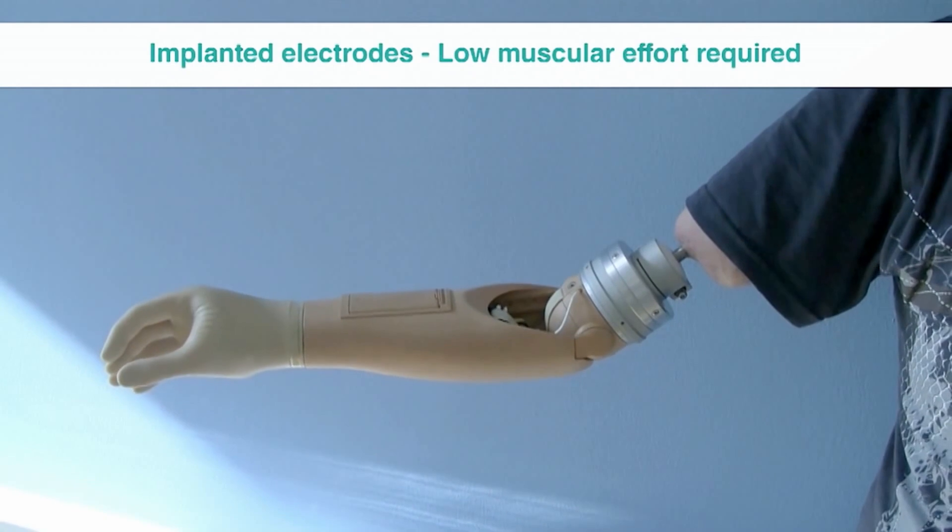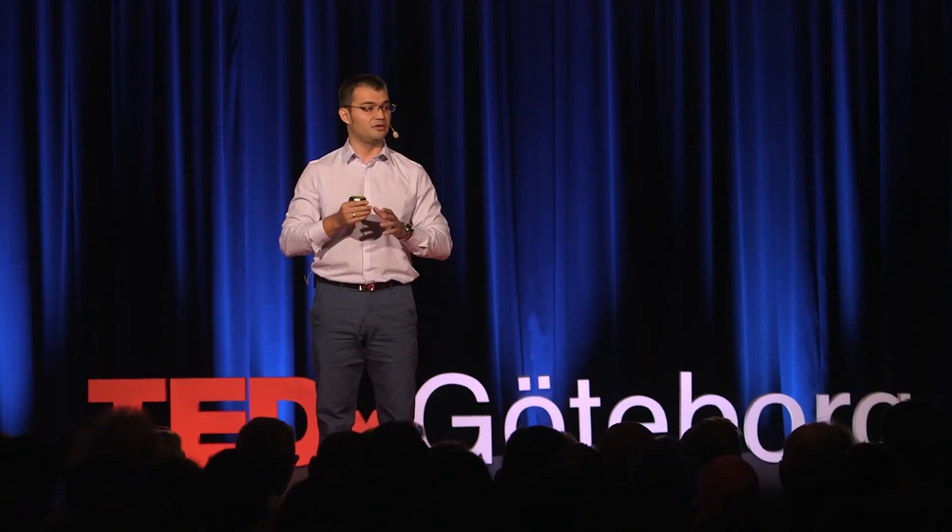But what does it mean for the patient? It enables more precise control of the hand with very little effort. We can treat patients, and they can take this technology home.